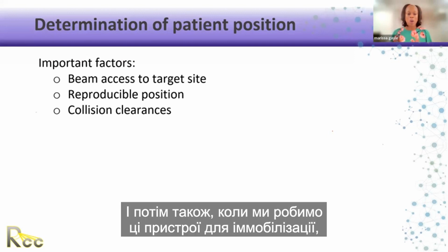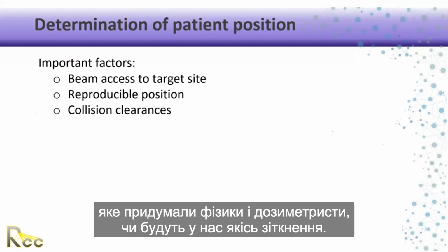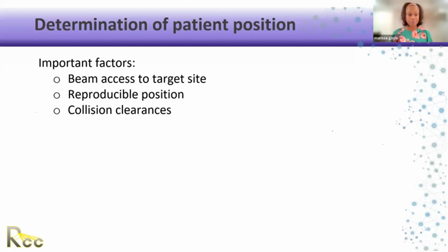And then also, when we make these immobilization devices, once we put them on the treatment table, depending on the field arrangement that physics and the dosimetrists come up with, are we going to have any collisions?